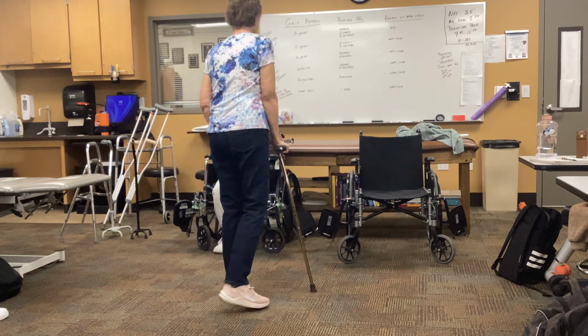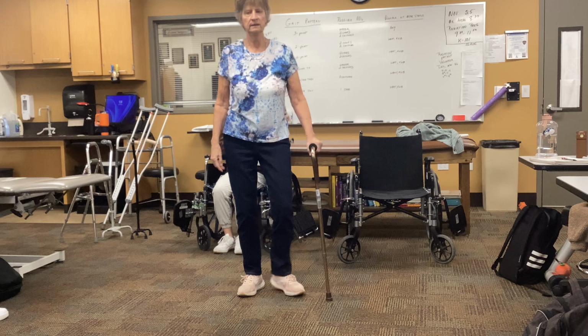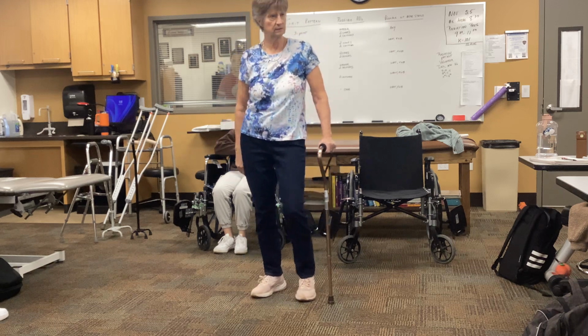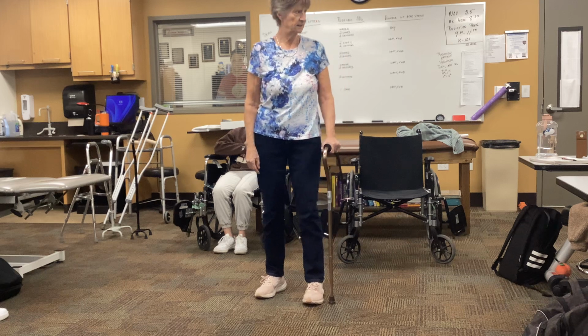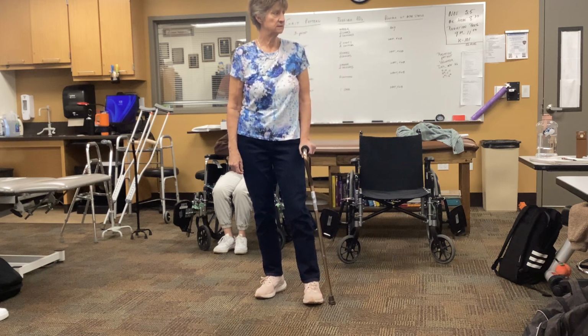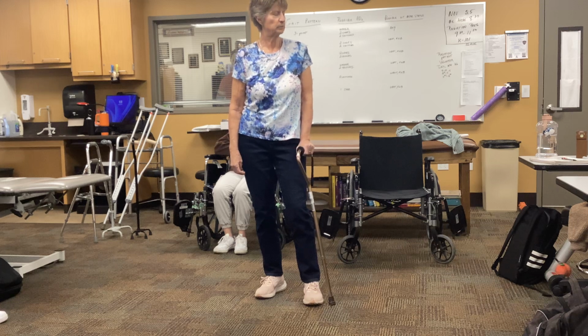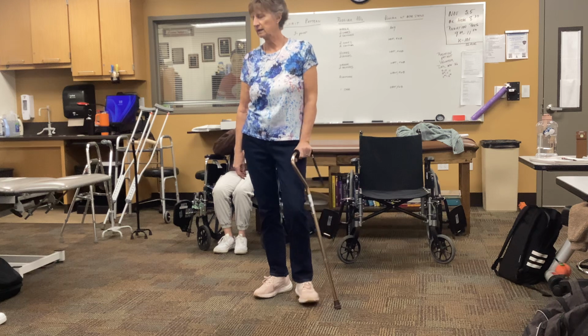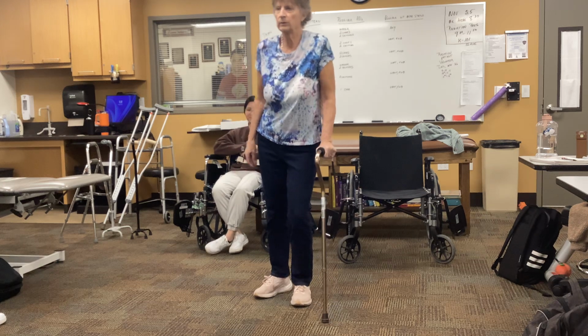Because if I put it on the bad side, how many people used to watch House? The show House? Yeah, where he was a doctor. Oh, yeah. Okay, so you probably didn't notice he had his cane on his bad side all the time. It would drive you crazy as a therapist, because then this is how he walked.